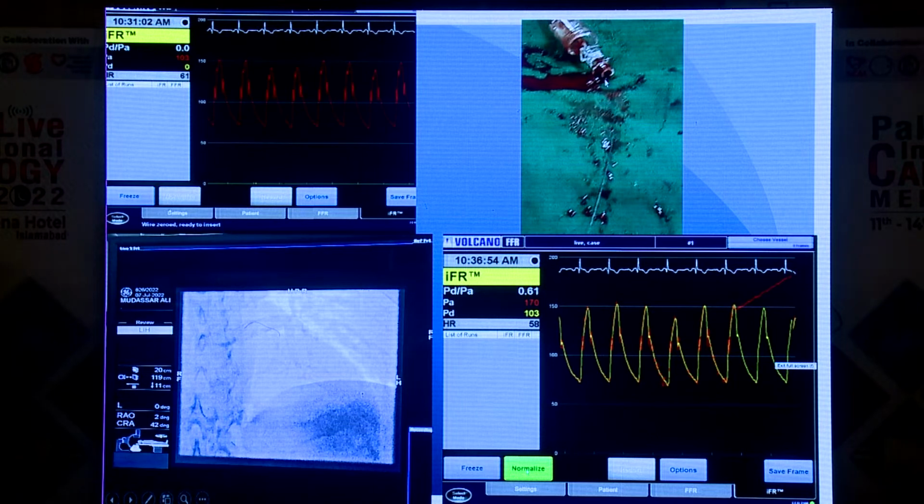After that, you're going to take your wire, use an insertion tool, advance the wire through the guide catheter, and bring the wire all the way to the tip of the guide catheter, the transducer portion. The transducer portion is the portion in the proximal part of the radiopaque segment. So this is the transducer portion. You bring it to the guide tip, and then at that point, you're going to take the insertion tool out and flush with saline. Contrast should be out. The guide that you use should not have side holes, because that can also drop a few millimeters of pressure and interfere with the readings. And before you insert the wire, make sure it's clean. There should be no debris on it. So all these steps need to be remembered when you're doing it to get an accurate reading.